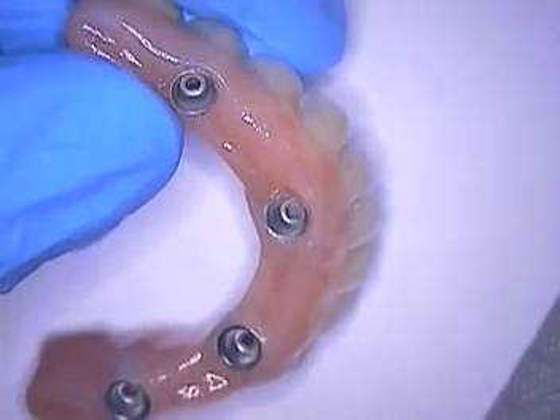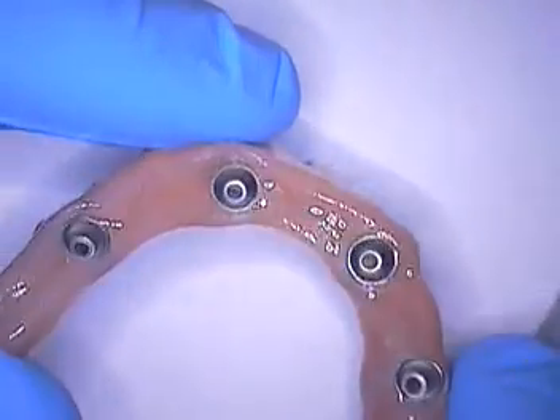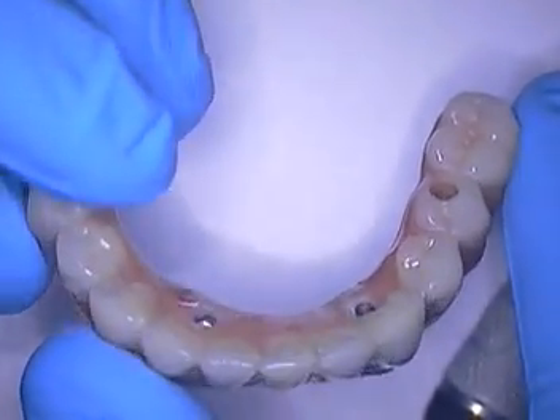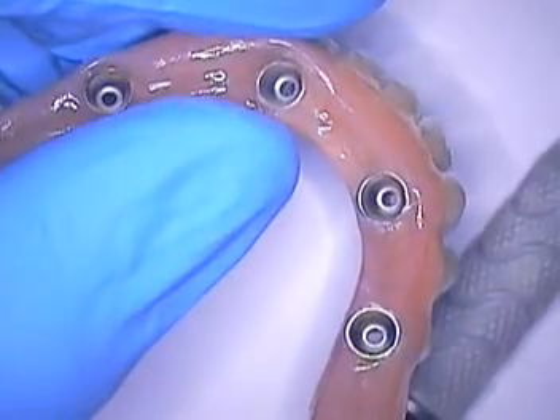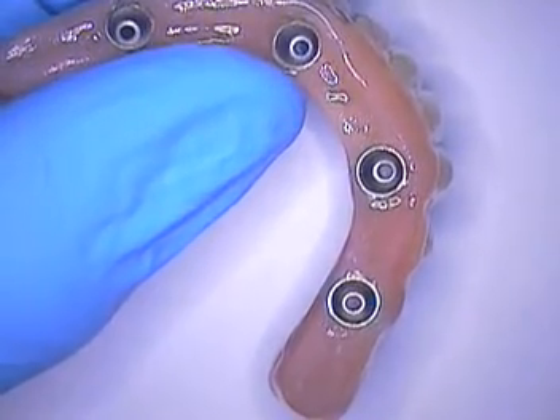As I always say in my other lectures, it's important to pay attention to details. Structurally, this is sound. The teeth look great. We're all anxious to put this in. But let's walk through some of the details you need to know as a prosthetic dentist, especially when you're getting a case back from your lab and they say everything is good to go.